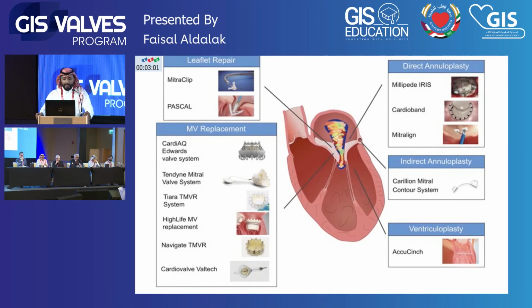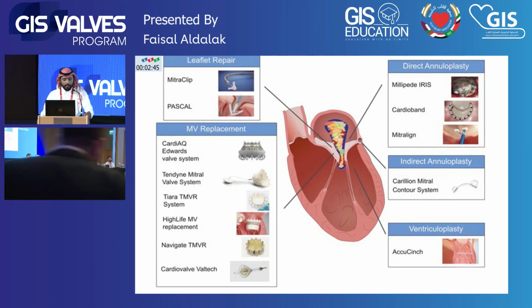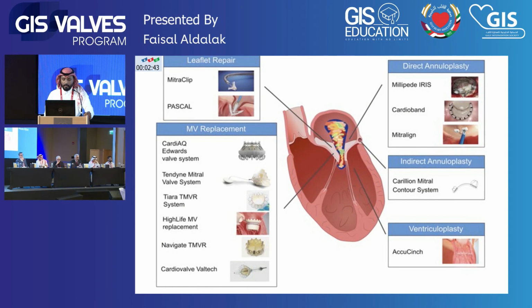And I'd just like to tell you that by this slide, we are going more efficient, percutaneous and less invasive. We will have a lot of interventions down the road. Mitral clip and Pascal, whichever you can see on the screen, is probably going to evolve in the coming few years, and we will have more interventions.